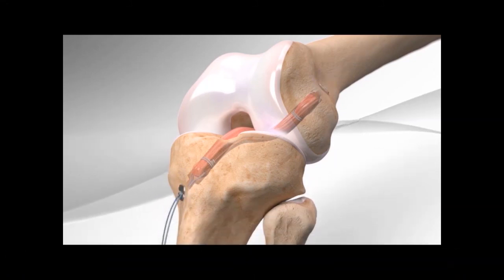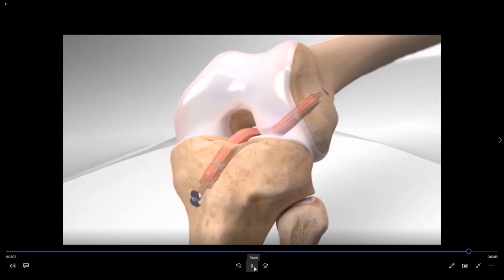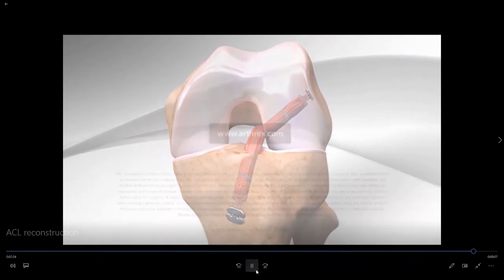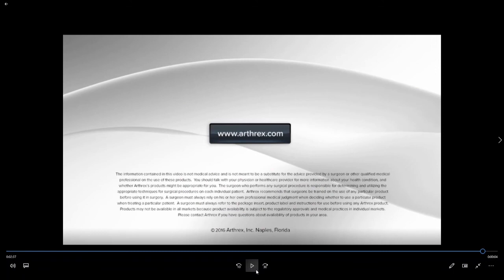The excess suture is then removed and we can see the final ACL reconstruction. I would like to thank my friends at Arthrex for supplying the implants necessary to perform state-of-the-art all-inside ACL reconstruction, as well as supplying the surgical animation used in this video. I hope this video has helped you understand the specifics of the surgical techniques required to perform an all-inside ACL reconstruction. Have a nice day.